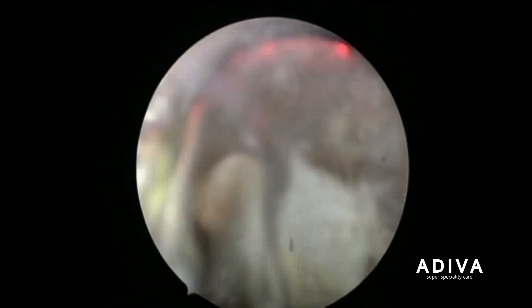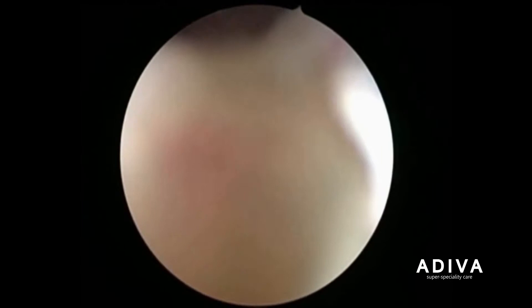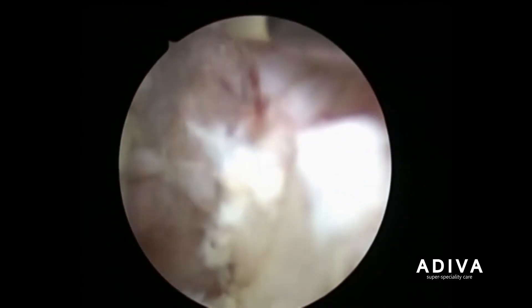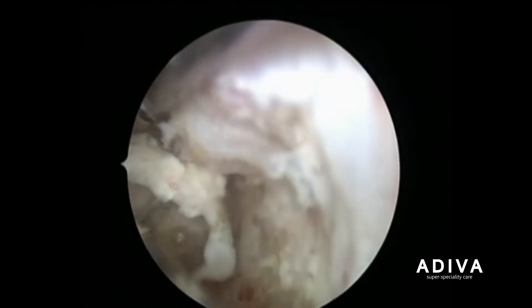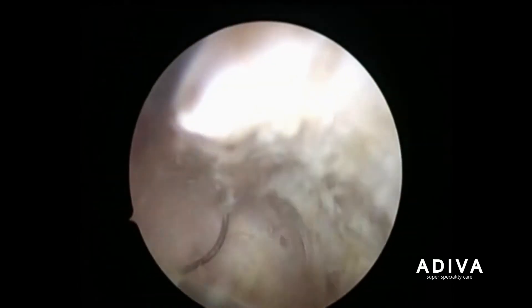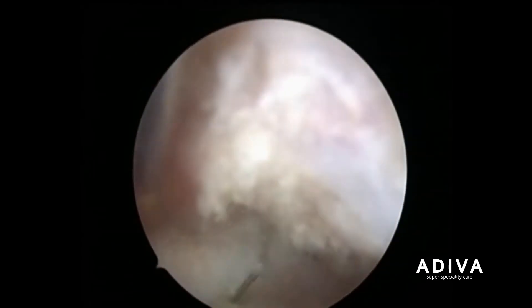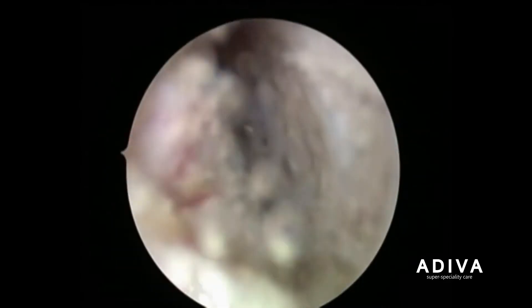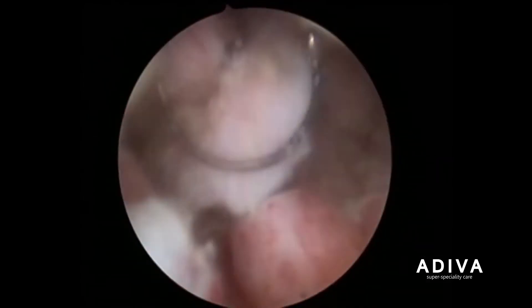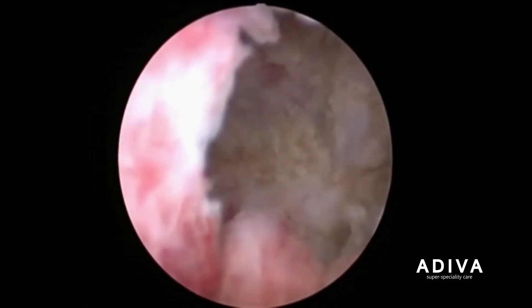The appearance of the adenoma is different than the capsule, and that is how experienced eyes are able to differentiate between the adenoma and the capsule. All this is adenoma, which looks a little more granular, and when we reach the capsule — the pink portion which is inside — that is the capsule.